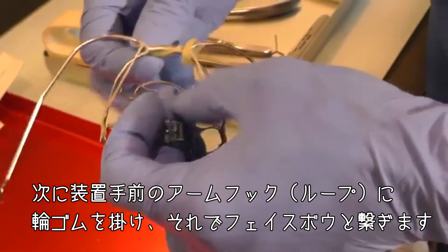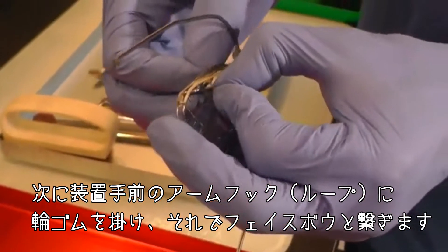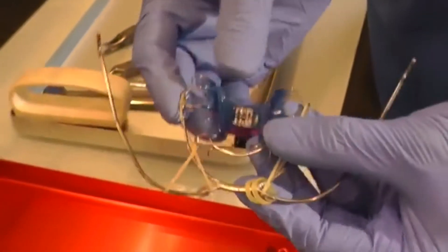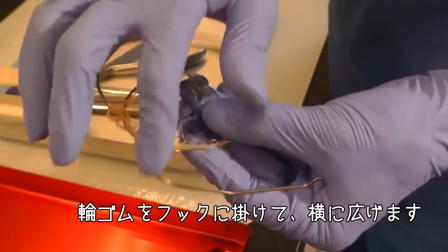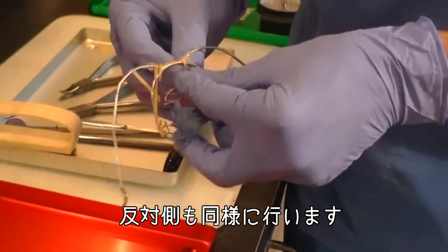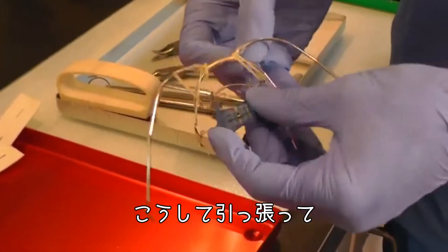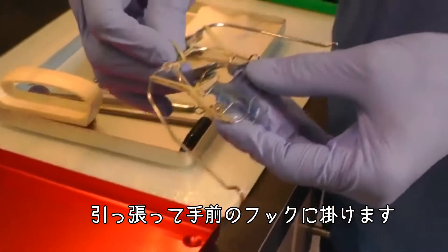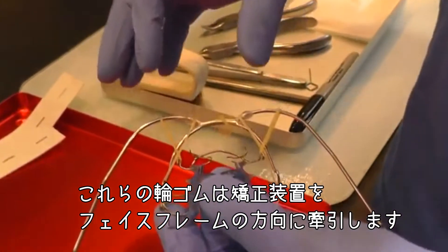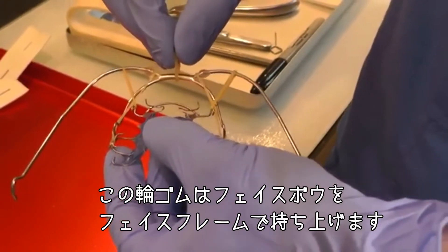The next one I need to connect to the face bow hook on the front of the appliance, and that comes out sideways. So I put that on the hook, it comes out sideways, and then I take the same on the other side of the appliance and connect that to the hook sideways. So these elastics are pulling the appliance to the face frame, and this elastic is pulling upwards on the face bow to the face frame.